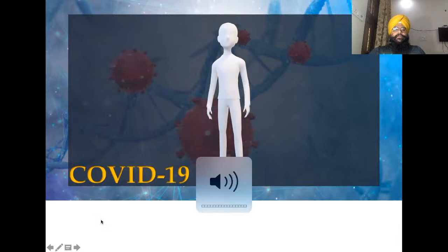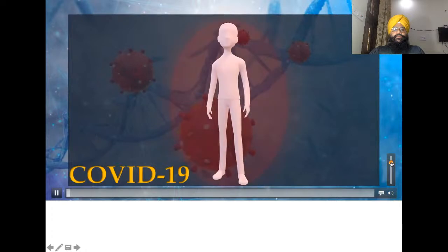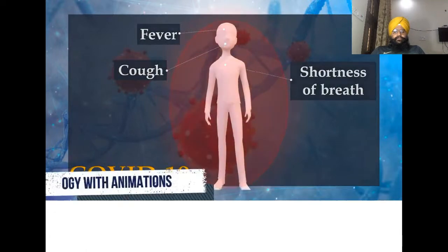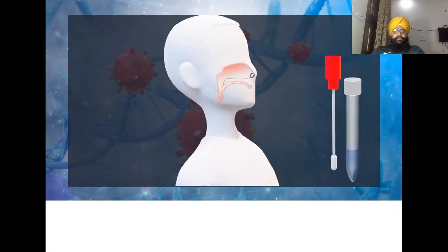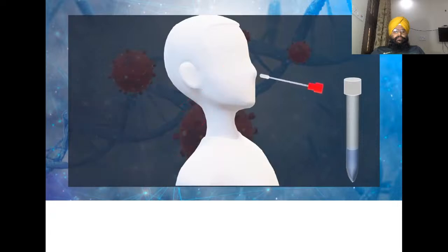COVID-19 is an infectious disease caused by severe acute respiratory syndrome coronavirus 2. When a person is infected, the most common symptoms include fever, cough, and shortness of breath. To start a test, the samples can be collected by a nasopharyngeal swab or an oropharyngeal swab. For a nasopharyngeal specimen, the swab is inserted in the nostril and gently moved forward into the nasopharynx, then it is rotated for a specified period of time to collect secretions that contain the virus.